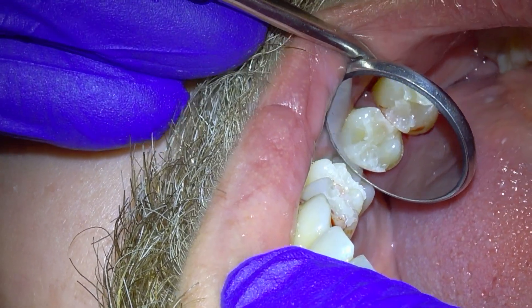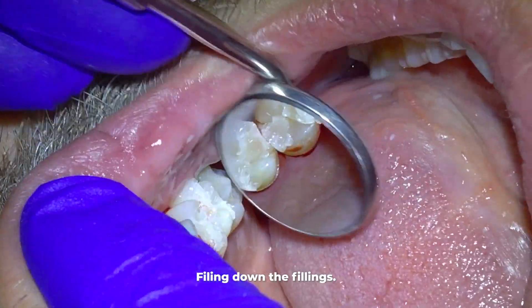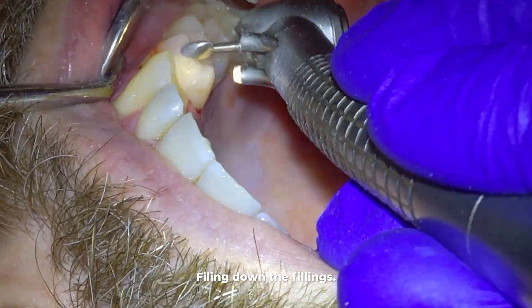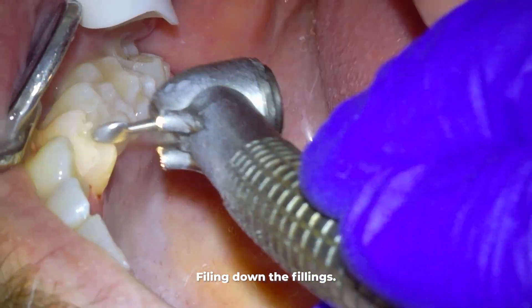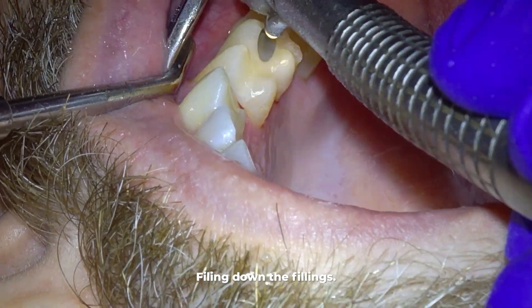What you see here obviously looks nothing like a tooth or how you'd want your filling to look, so we must file it down until it looks and feels like a tooth. When I say it feels like a tooth, that means when you bite down it shouldn't feel uneven or off.